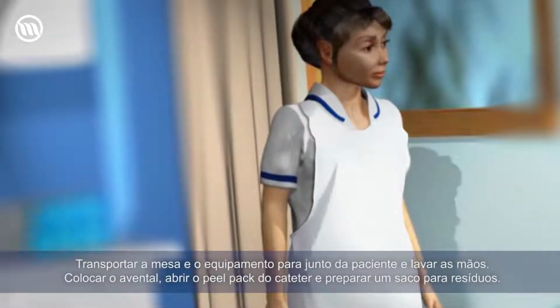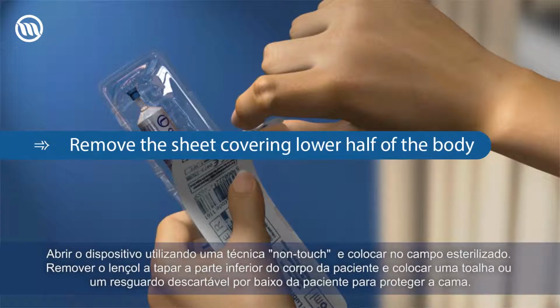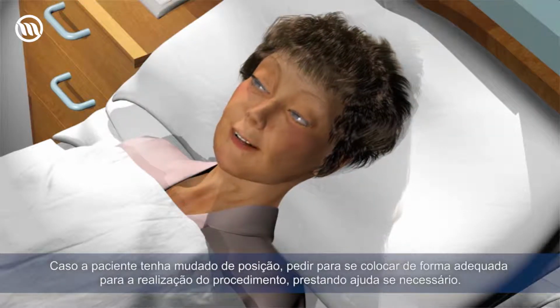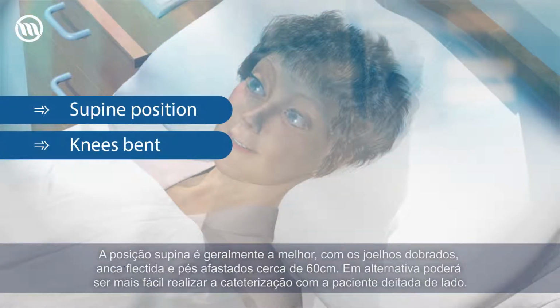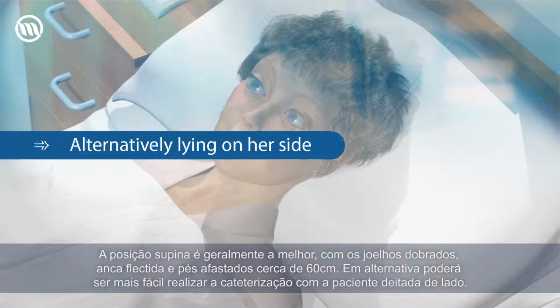Put on the apron, open your catheter, and position a waste bag. Using a non-touch technique, open your equipment onto the sterile field. Remove the sheet covering the lower half of the body and position a towel or disposable pad under the patient's bottom to protect the bed. If the patient's position has changed, ask her to get into a suitable position for you to carry out the procedure, helping if required. A supine position is usually best, with knees bent, hips flexed, and feet about 60 centimeters apart. Alternatively, it may be easier to catheterize the patient with her lying on her side.